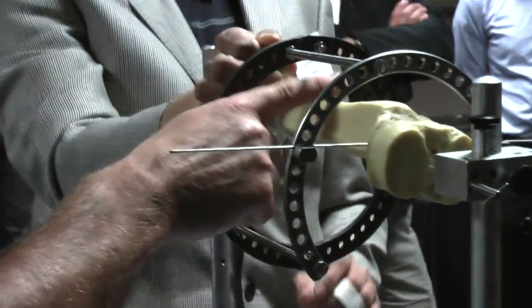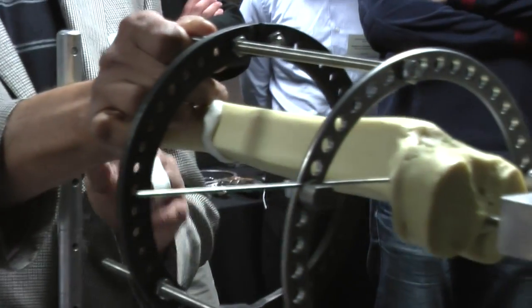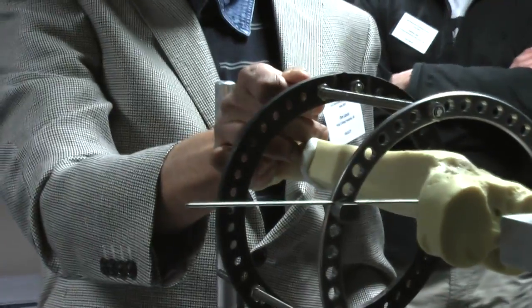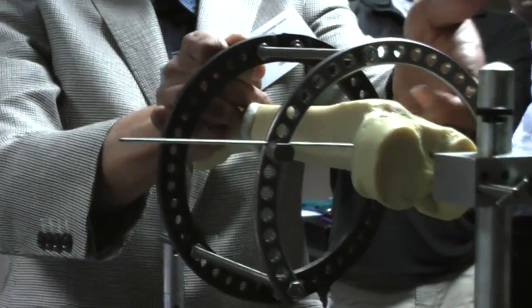We need this rod about parallel to the front of the tibia. All right? About there? Yeah. Okay. Leave that to hang there. And then... The front or the back? The front. So you can't see the back. Drop it a little bit then, so you can run your fingers on it. Drop it a little bit, distally.